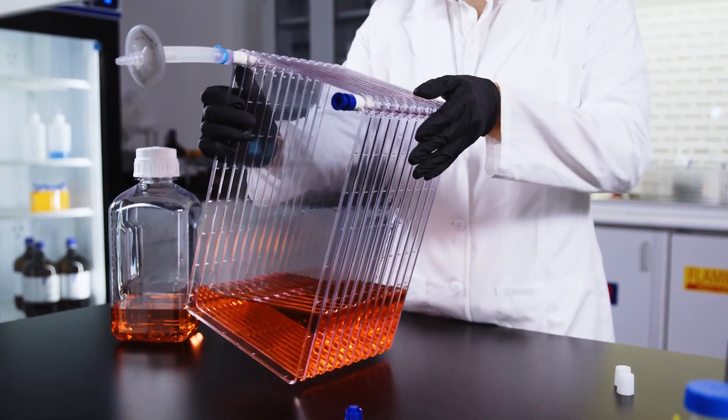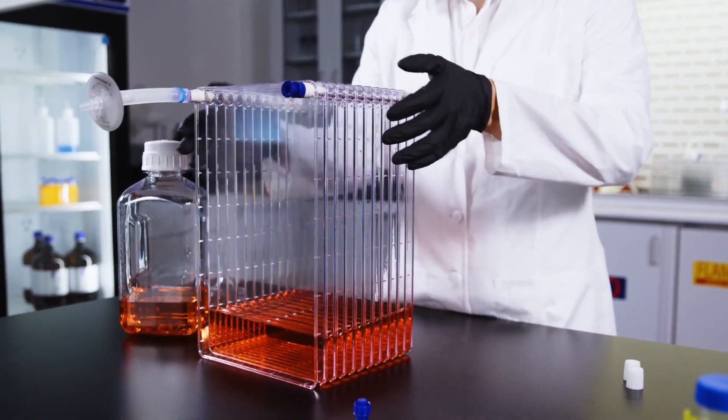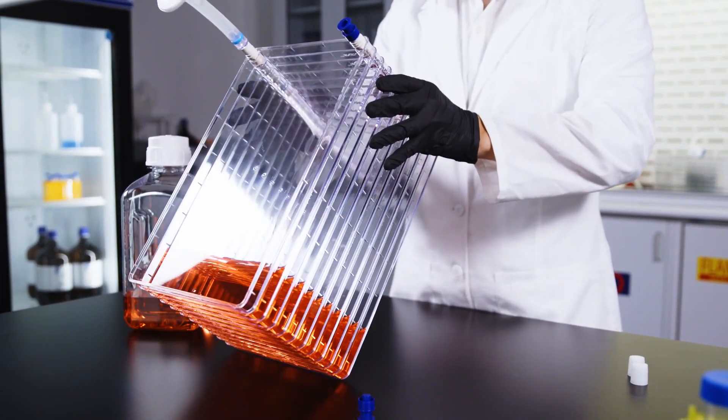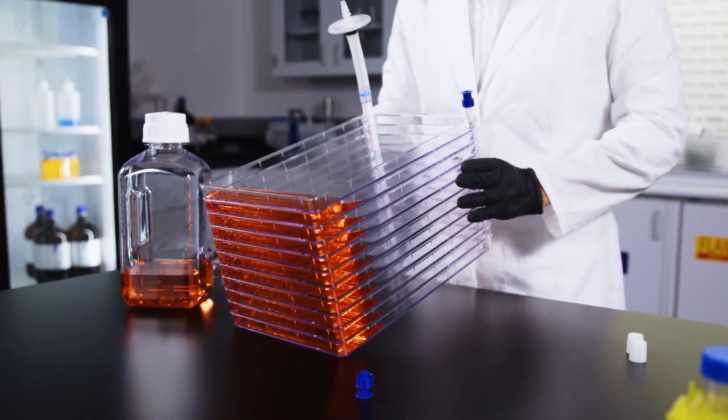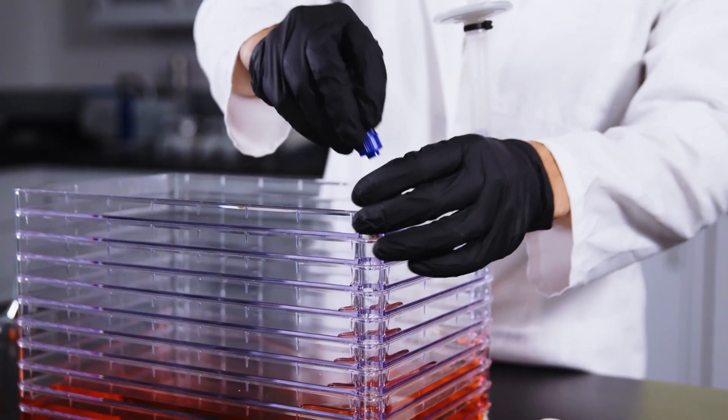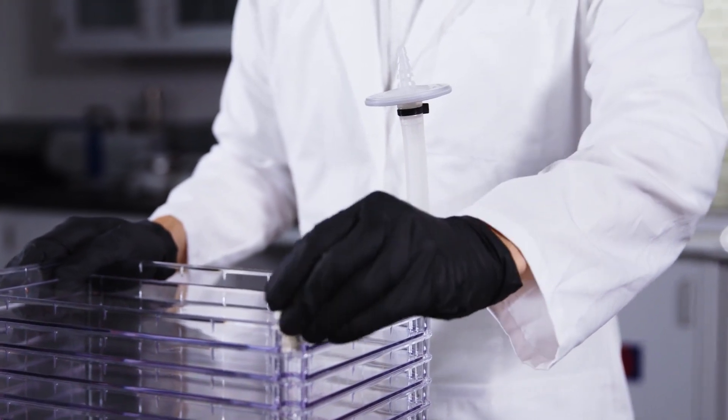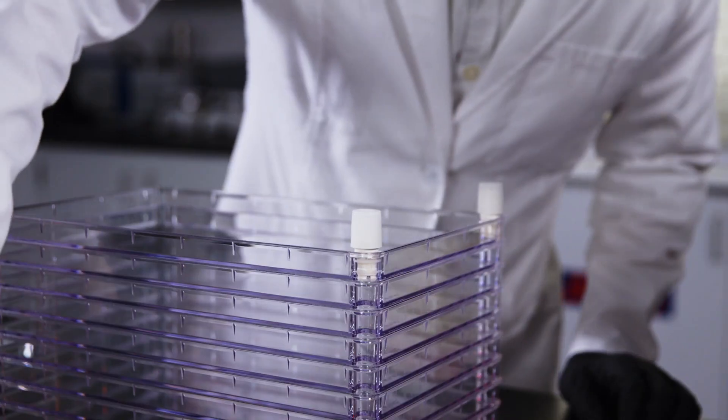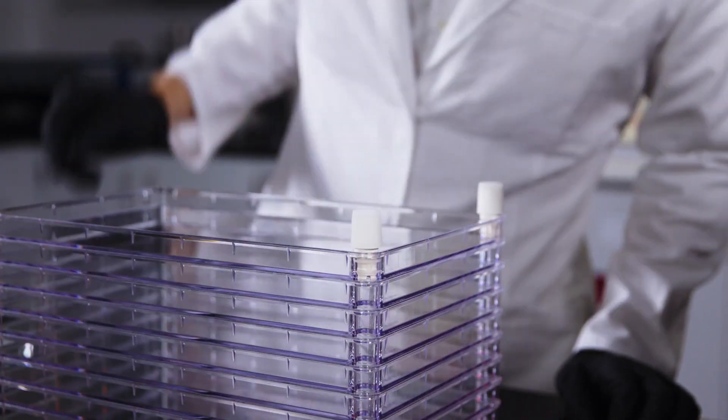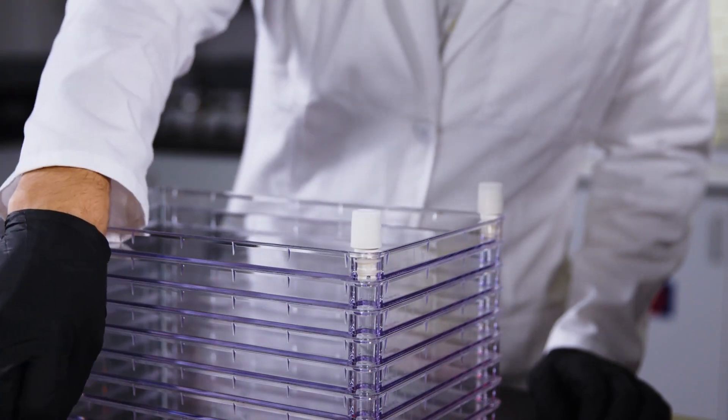Once the medium has fully leveled out, turn the NUNC cell factory system on its short side with the ports facing upright. Take off the blue cap and screw on the white filter cap or secondary venting filter. Make sure all white caps are screwed on securely. You may then move the cell factory system to an incubator.